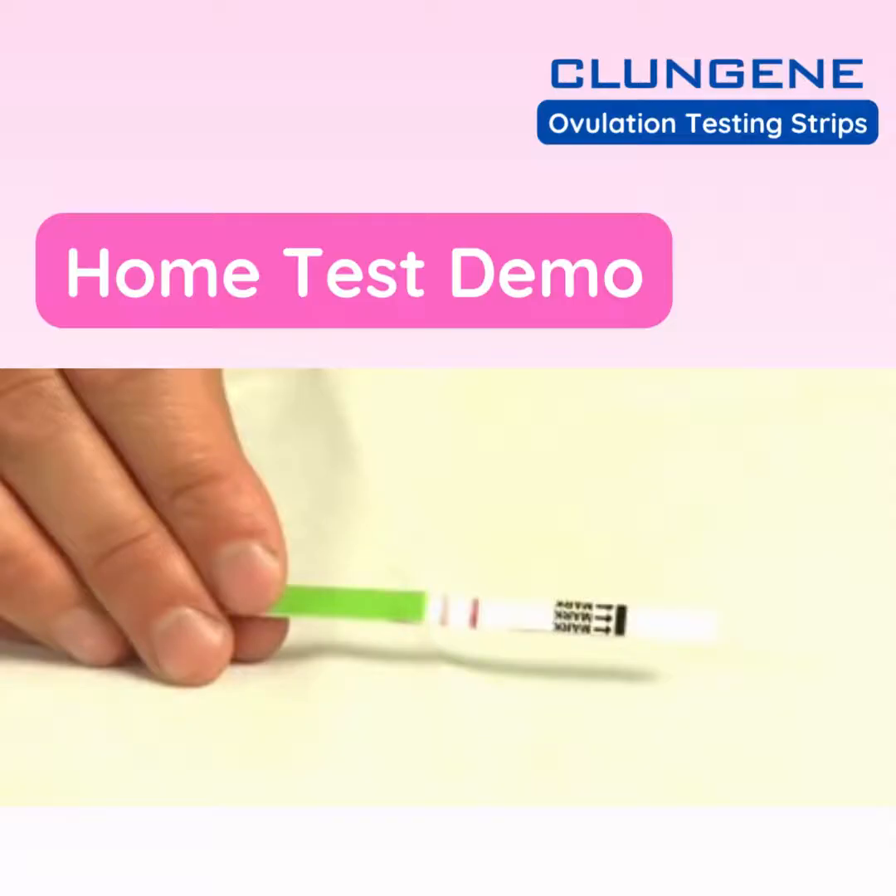Note that we've compressed the 10-minute time period into just a few seconds for the purposes of the video. With an ovulation test, unlike a pregnancy test, you compare the intensity of the test line to the intensity of the control line. If the test line is as dark or darker than the control line, that indicates a positive result, and you will probably ovulate within the next 24 to 48 hours.